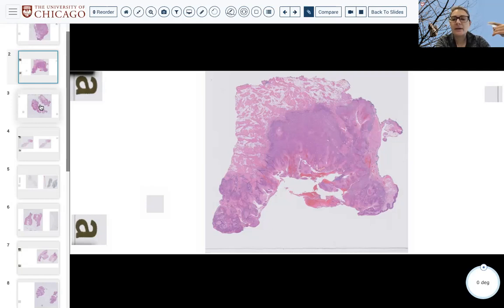Fibrosis from treatment effect can be challenging. Sometimes little lobules of salivary gland tissue that look kind of white, like in the floor of mouth, can also be challenging. But I think not only color, but texture and subtle features of the nearby tissue can help. So it's not always obvious though. Sometimes you think, I don't know if this is tumor or scar.